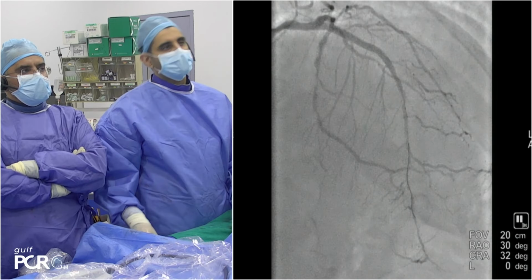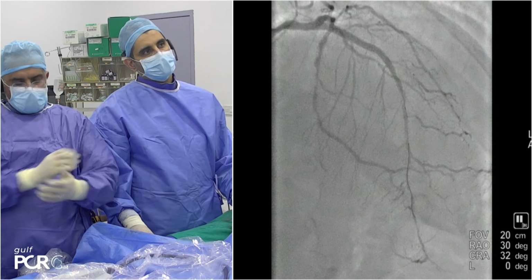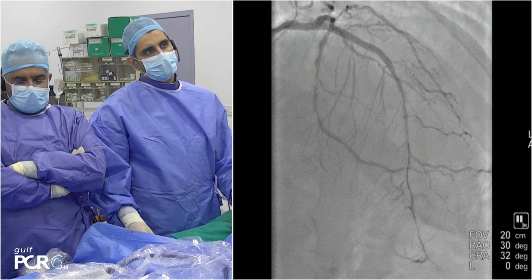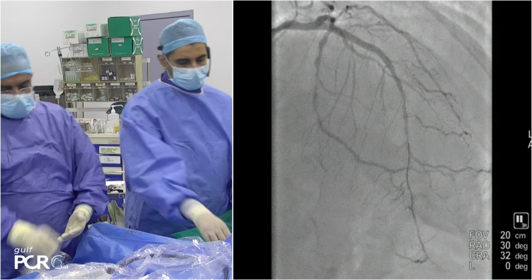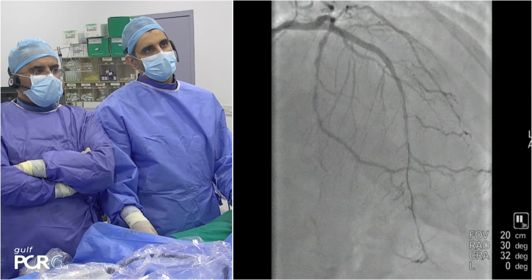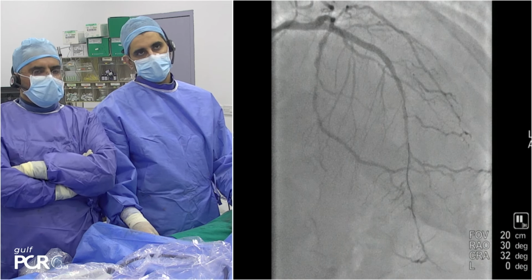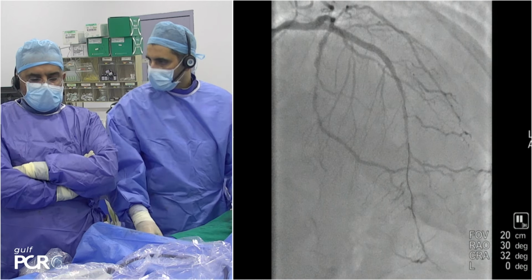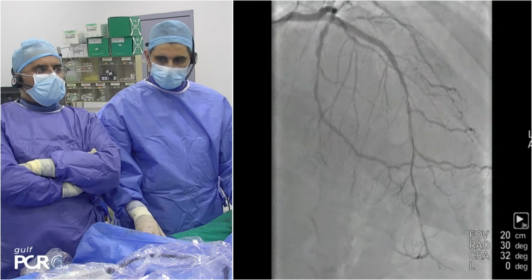Would you extend the stent distally? Would you stent the distal outflow? Okay, I know that I'm challenging you, but if you watch the OCT images, this vessel is much, much bigger in terms of EEL. You have multiple zones distally, but in fact it's a super diffuse disease. So at this point, if I needed to do something, I will not stent this vessel, and eventually I will go with a drug-coated balloon, just to open up, but the most important is to take care of the exit of the distal stent that now is underexpanded plus thrombus.